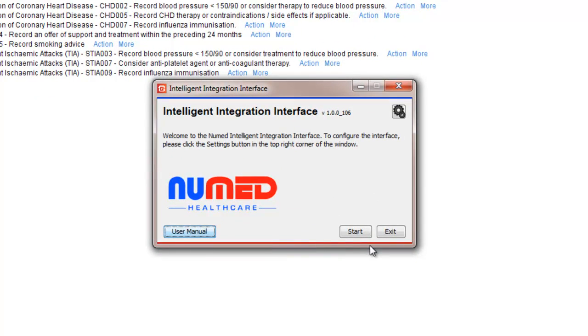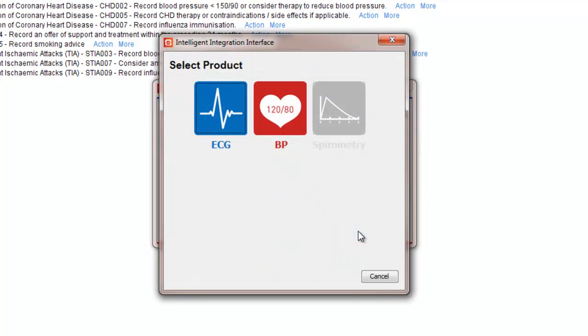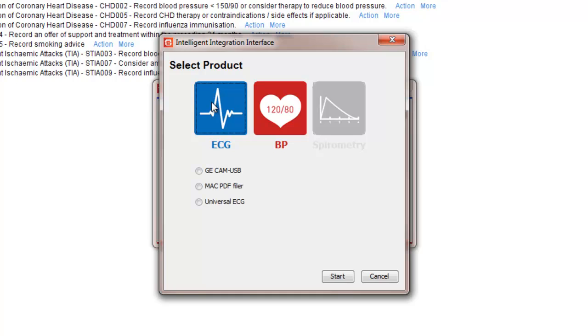Clicking the Start button will take you to the Product Selection screen. Click the ECG button. If you are using more than one type of ECG machine, a sub-menu will appear. Ensure that Universal ECG is selected, then click Start again.